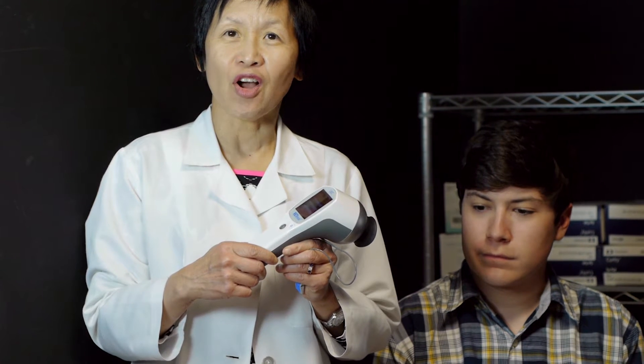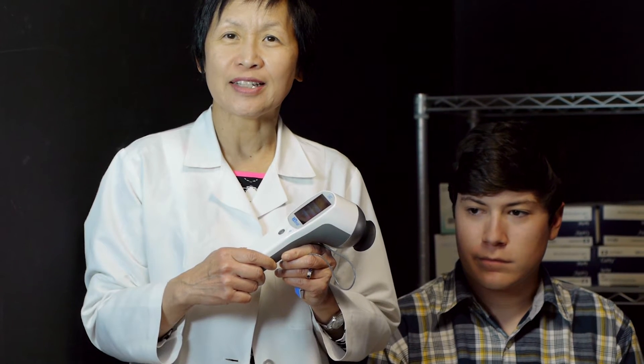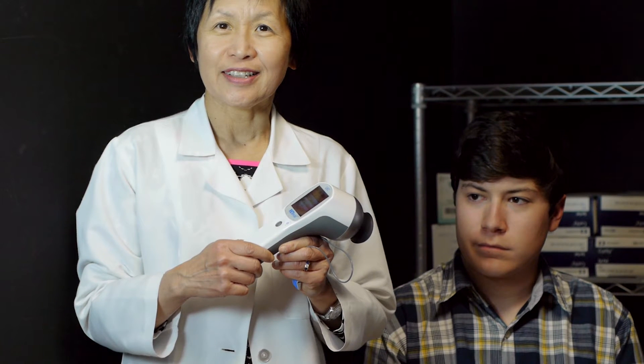Thank you for listening to us. This is about retina eval, this new ERG device that's handheld. If you have any questions, call us. I'm Dr. Gloria Wu, San Jose, California, retina surgeon. Thank you.